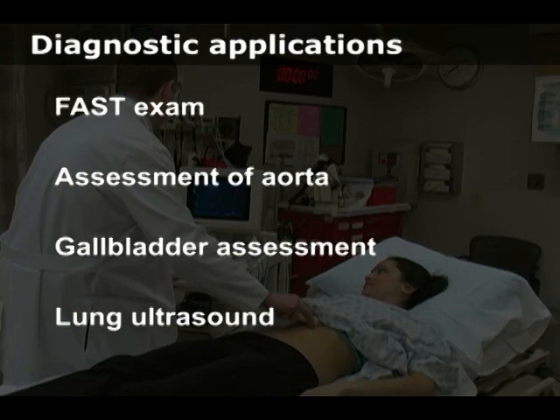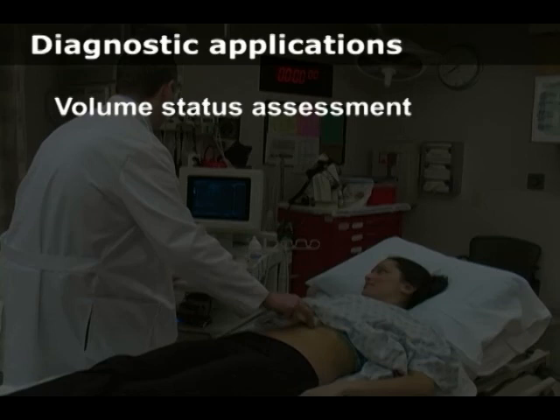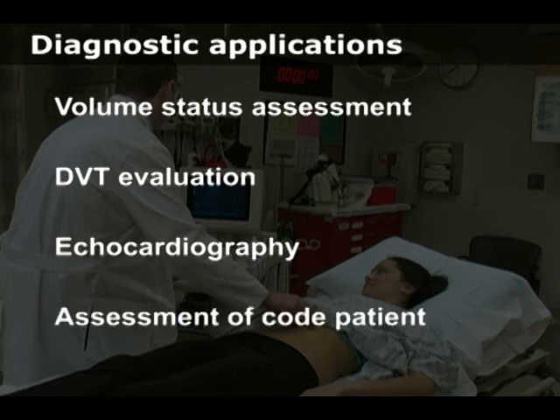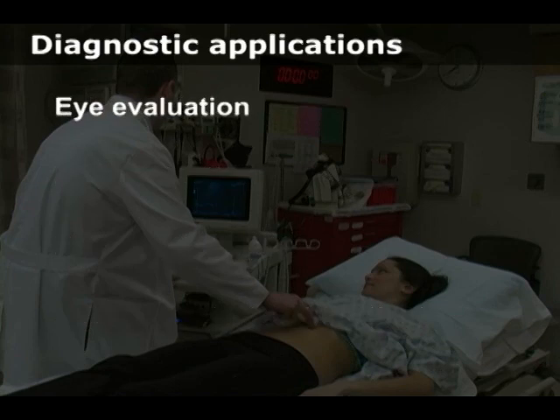Diagnostic applications include the FAST exam, ultrasound assessment of the aorta, gallbladder assessment, lung ultrasound, such as for detection of pneumothorax, hemothorax, or CHF, volume status assessment by inferior vena cava assessment, DVT evaluation, basic echocardiography, such as for pericardial effusion detection, critical assessment of the code patient, evaluation of the eye for optic emergencies, such as retinal detachment.